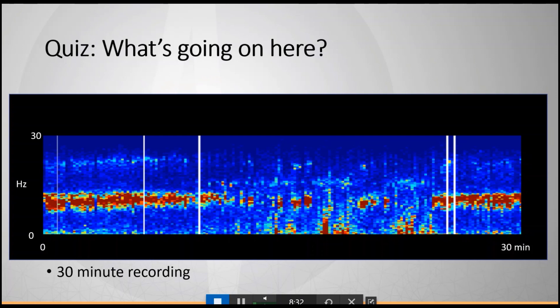This is a normal sleep recording during a routine EEG. You have the initial wake portion with the majority of activity in the alpha range, then the alpha dropout as the patient falls asleep — probably vertex waves, sleep spindles, and stage 2 sleep in there — and then an arousal, and they are awake for the remainder of the study.